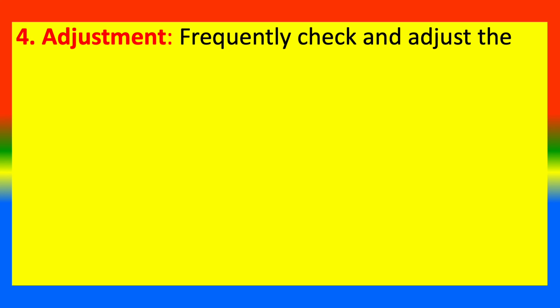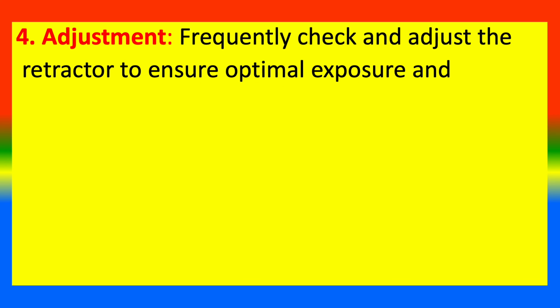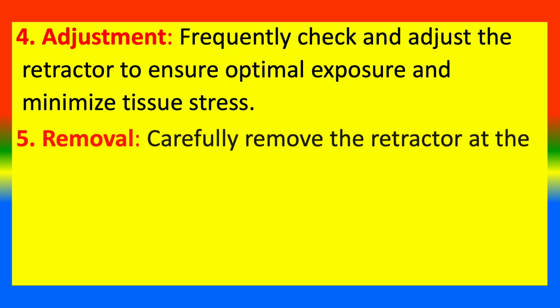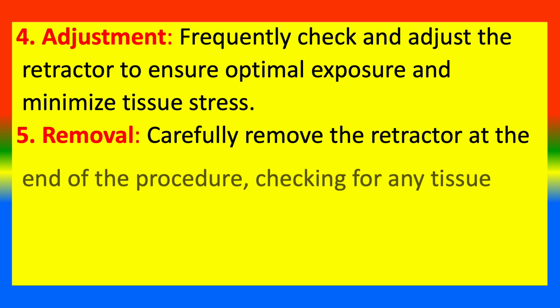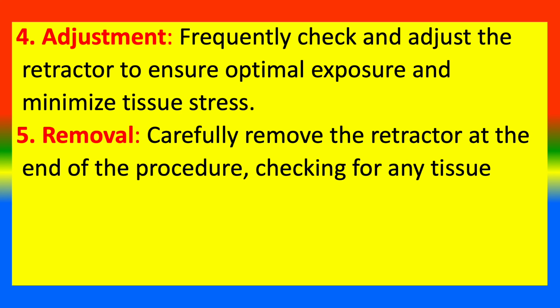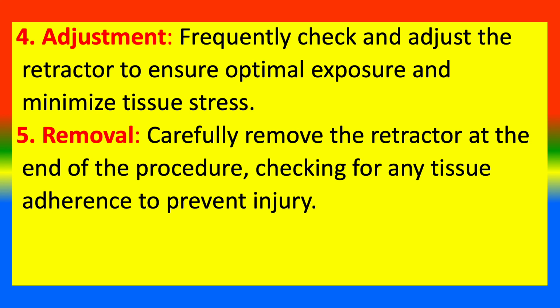4. Adjustment. Frequently check and adjust the retractor to ensure optimal exposure and minimize tissue stress. 5. Removal. Carefully remove the retractor at the end of the procedure, checking for any tissue adherence to prevent injury.